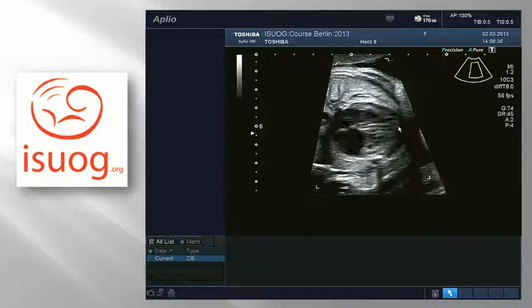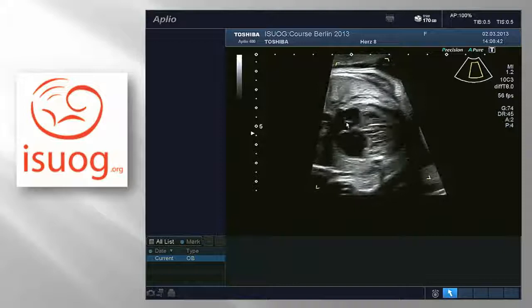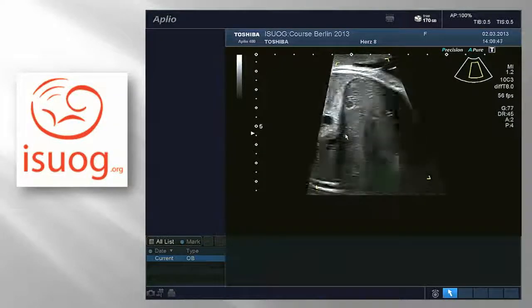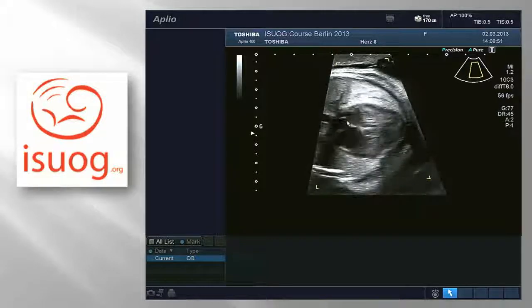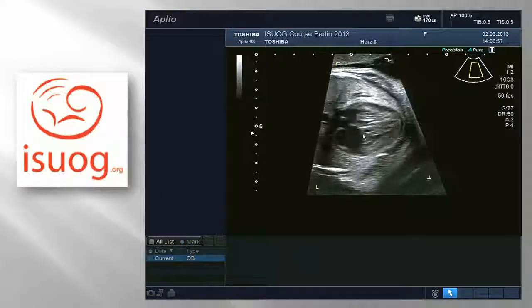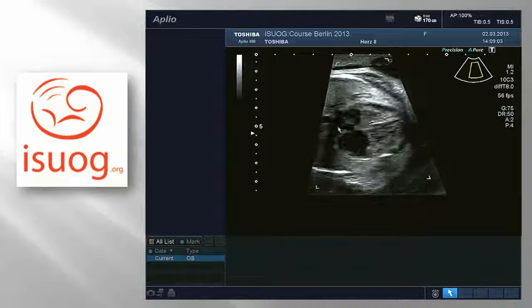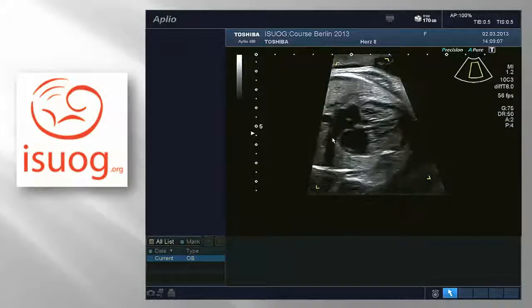The axis is 45 degrees to the anteroposterior line. The situs is normal, like that. It just means that the atrium on the right here is the right atrium, and the atrium on the left is the left atrium, which is as it should be. And then, following the cardiac guidelines, we would do a four-chamber view, starting from the entrance here of the pulmonary veins. We can see one coming here.